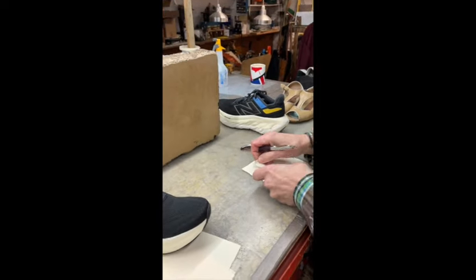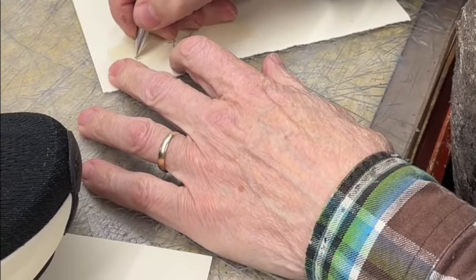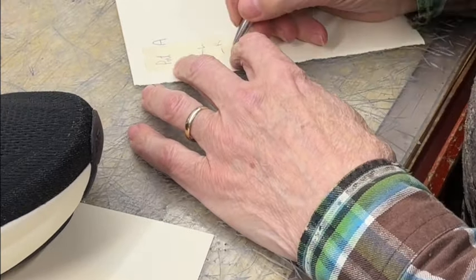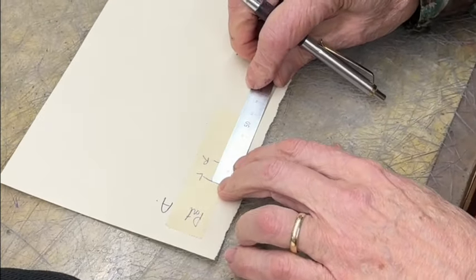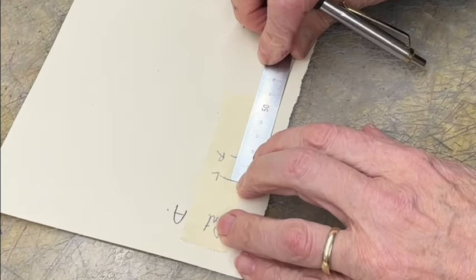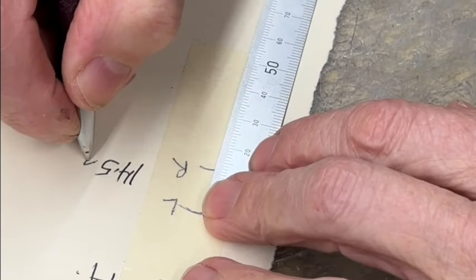Take it off, put it on the client's information sheet — this is Patient A, that's the left and that's the right. It's the difference that's relevant rather than the actual heel height, and you can see the actual difference is very accurate: 14.5 millimeters.